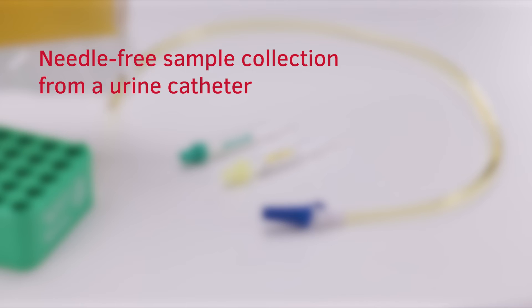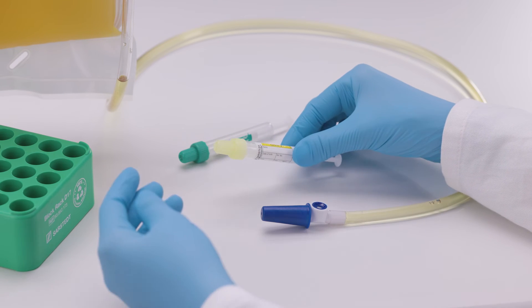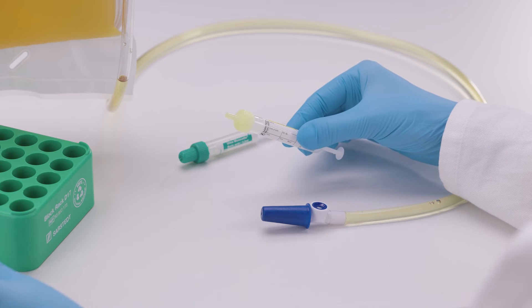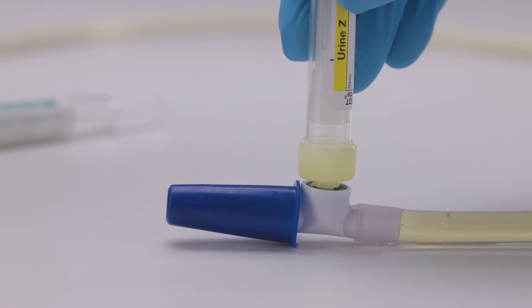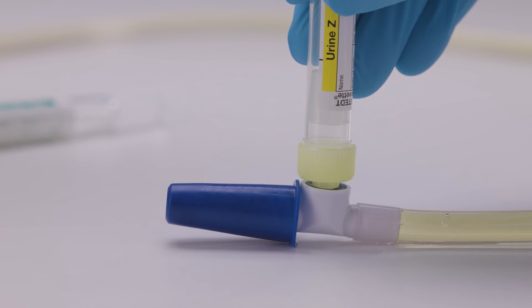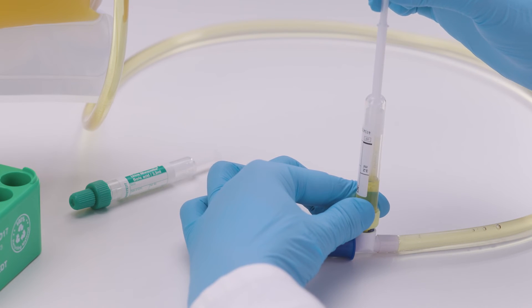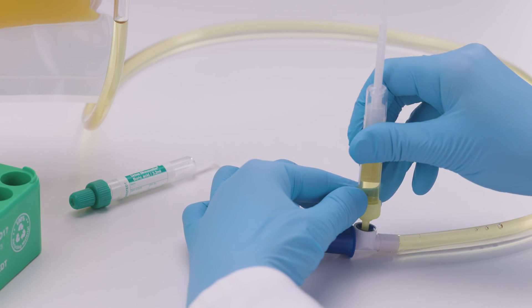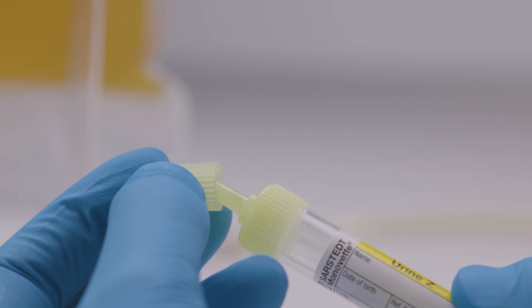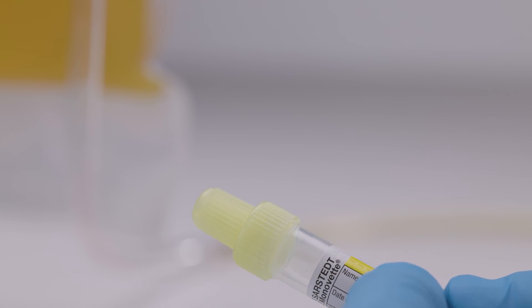Close the urine MonoVet and make sure not to leave a gap between stopper and screw cap. Break off the piston rod. Needle-free sample collection from a urine catheter. With Sarsted's urine MonoVet, no equipment with a cannula is needed when collecting samples from a urine catheter. Remove the stopper from the tip of the urine MonoVet. After clamping the tubing, connect the urine MonoVet directly to the urine catheter collection site. Press firmly to pierce the membrane at the collection site. Pull the piston back towards the bottom of the urine MonoVet and wait until no more urine flows in. Disconnect the tube from the collection site. Close the urine MonoVet and make sure not to leave a gap between stopper and screw cap. Break off the piston rod.